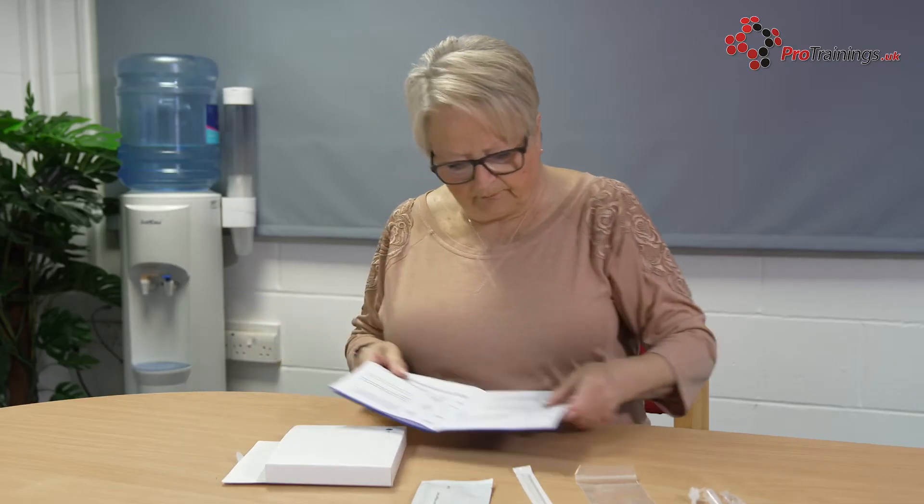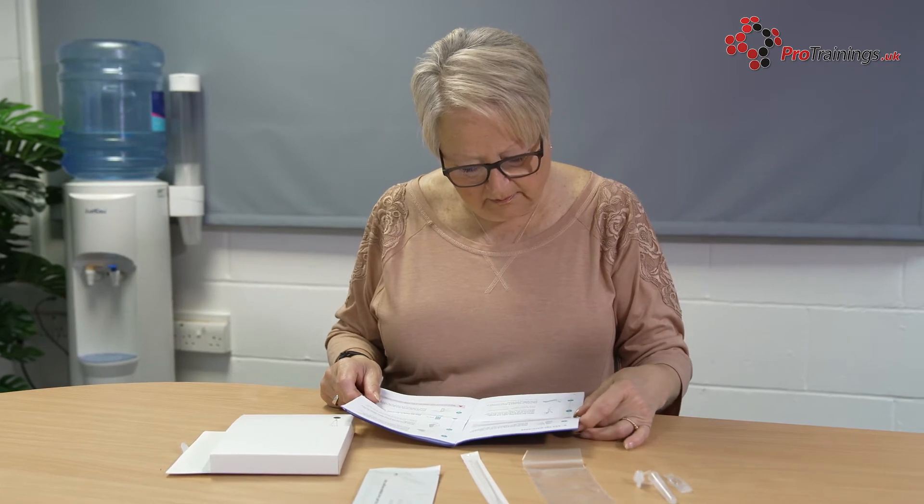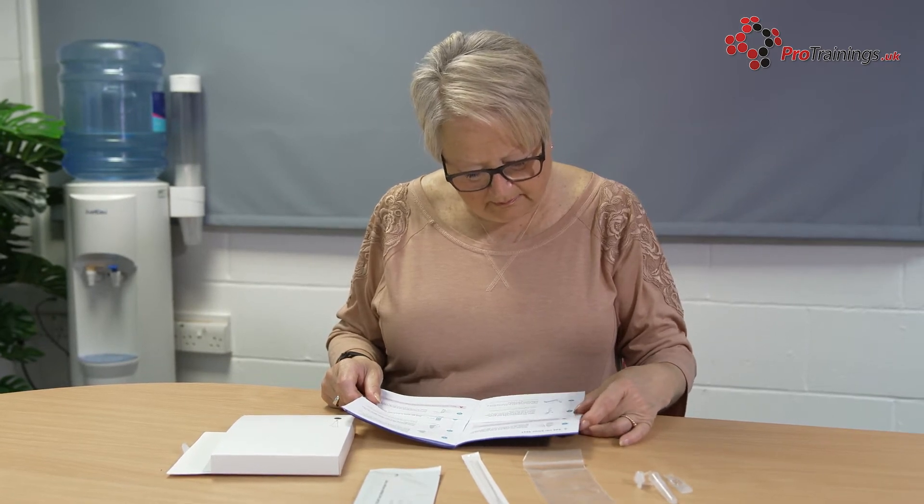Self-test kits are single use and easy to use. You should not eat or drink for at least 30 minutes before taking the test to avoid the risk of spoiling the results. If you have problems with your vision, it's best to have someone there to help you read the results, and if you have problems with your hands, you may need someone to help you take the test.